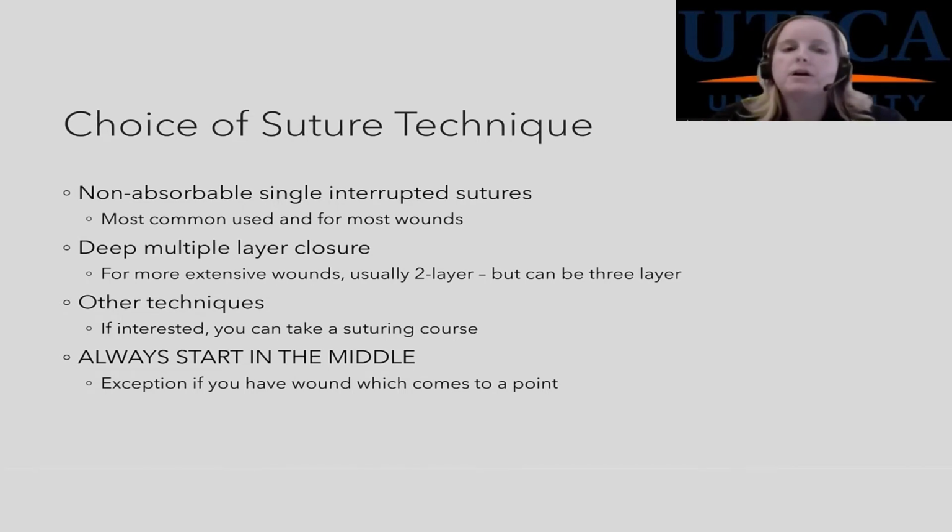Now a question is, sometimes I have to take my sutures out. That's okay. Especially if you have a big flap, sometimes it's hard to get it down. Sometimes you have to put in sutures that aren't going to stay in. You put the suture in to hold it down, then you put more sutures in and then you take that one out. That suture was just to hold things down until you move things around.